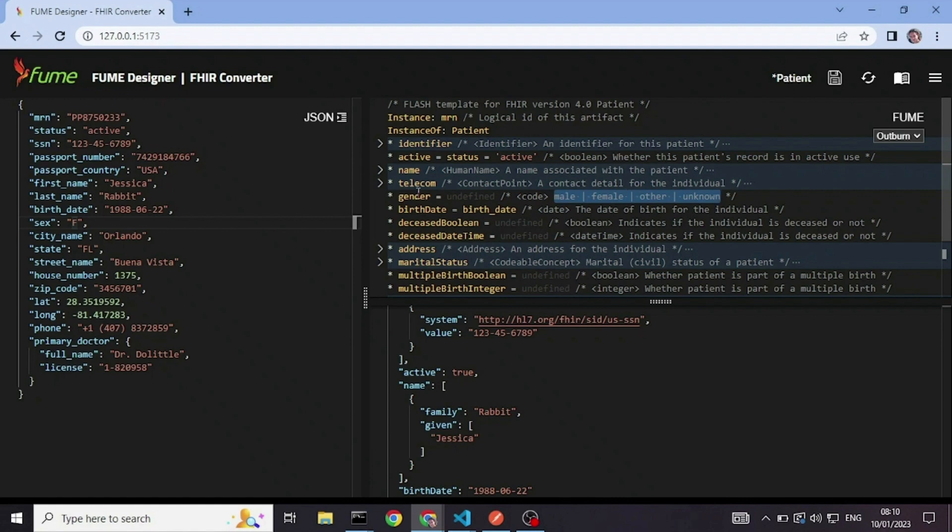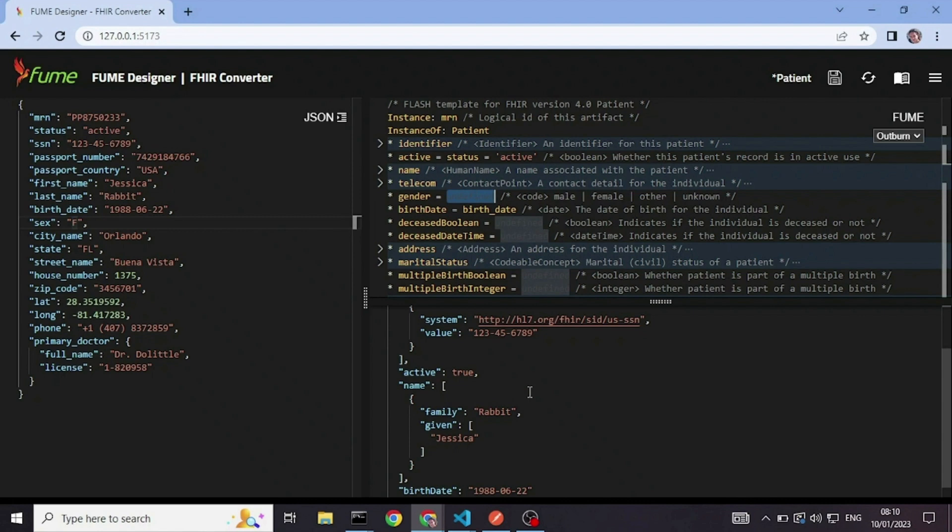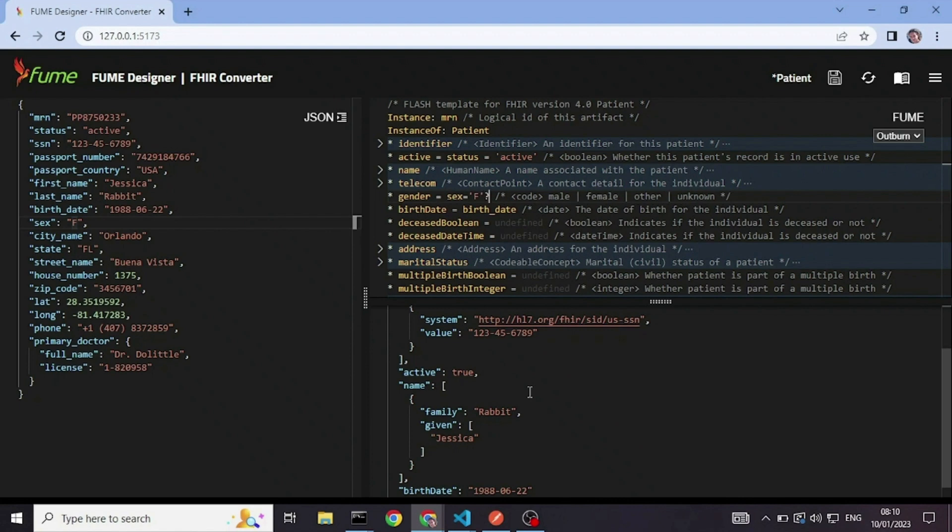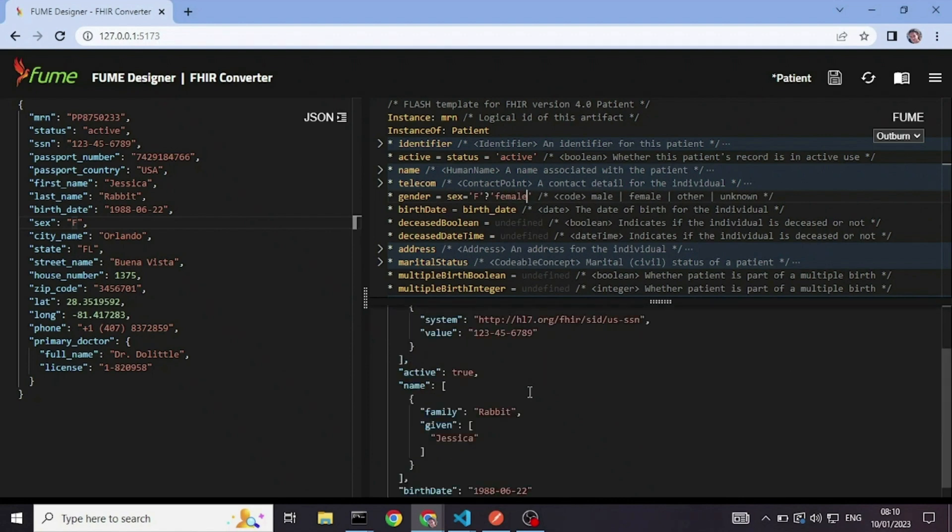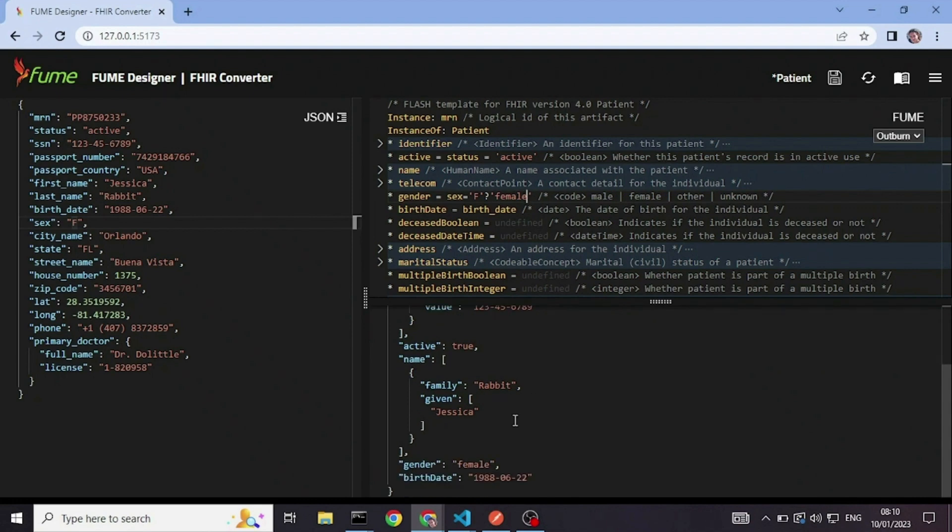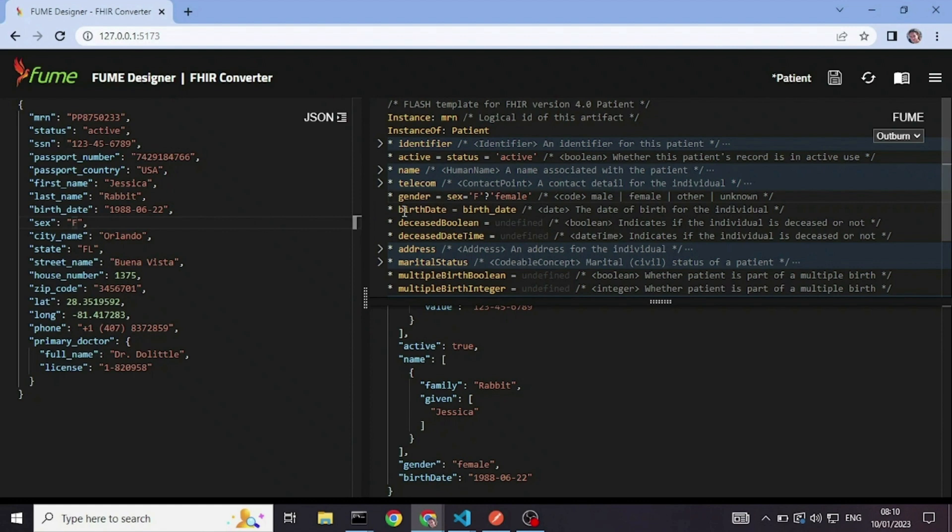And those are the only possible values for this field. So since this is a very small value set, I can write it in conditions. So I will just say if sex equals f, then female. And I get female. I can, of course, continue writing the mapping for all the codes. But for our example, I think this is enough.